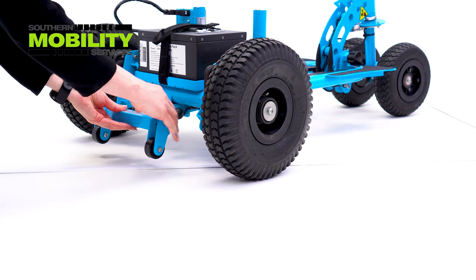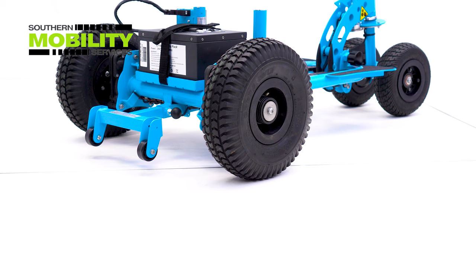The anti-tips are on all Super Scooter models. They are a safety feature and are easy to pull in and out.